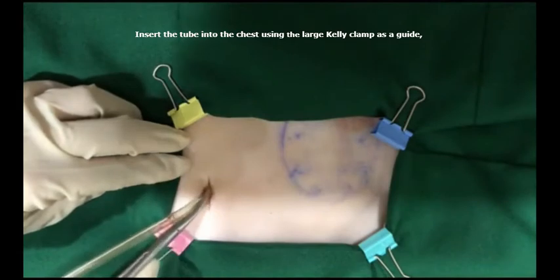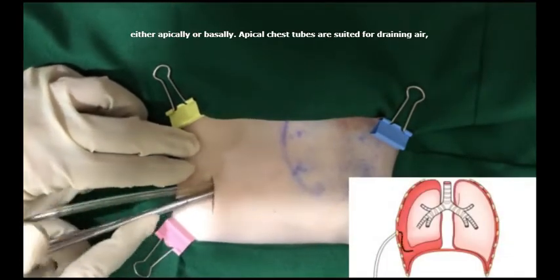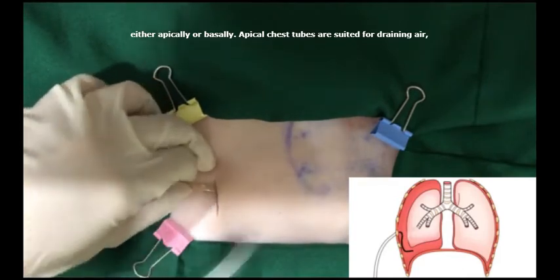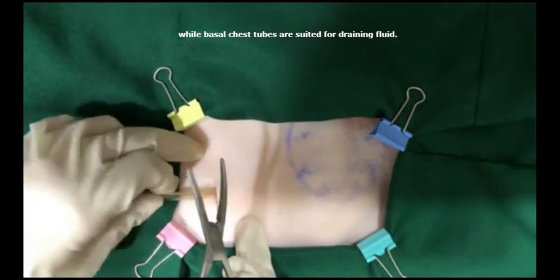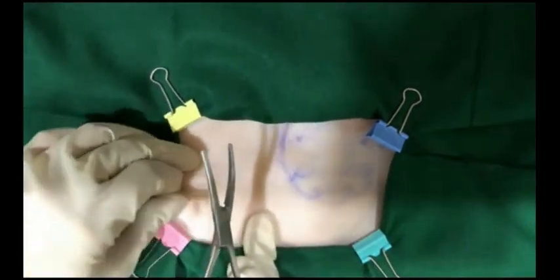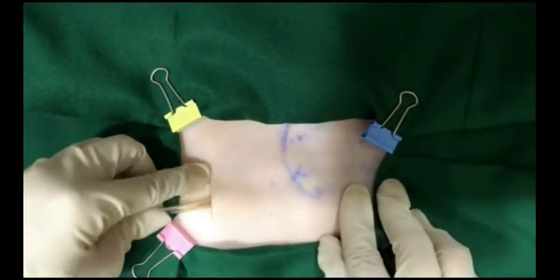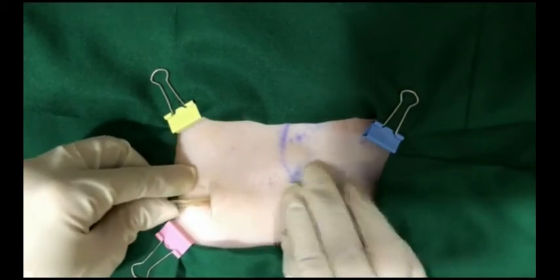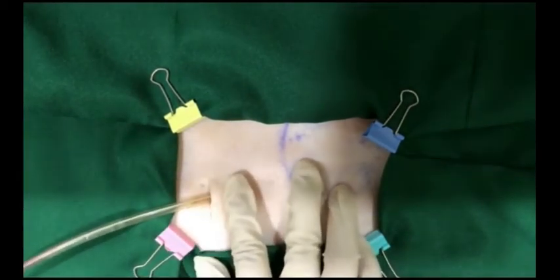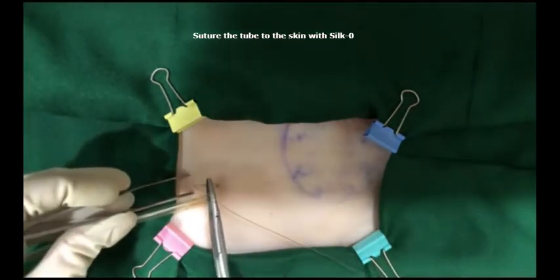Insert the tube into the chest using the large Kelly clamp as a guide, either apically or basally. Apical chest tubes are suited for draining air, while basal chest tubes are suited for draining fluid. Palpate to ensure that the tube has entered the chest. Suture the tube to the skin with Silk O.